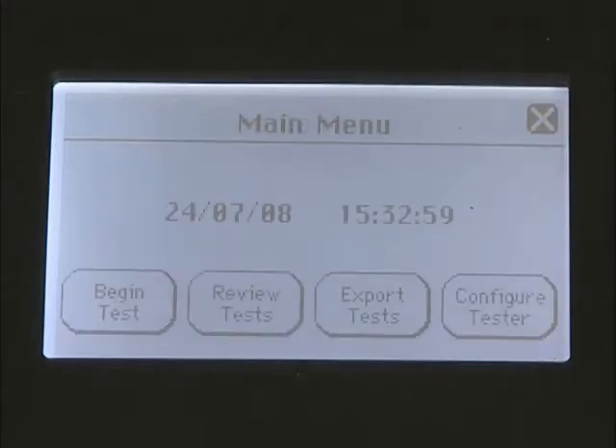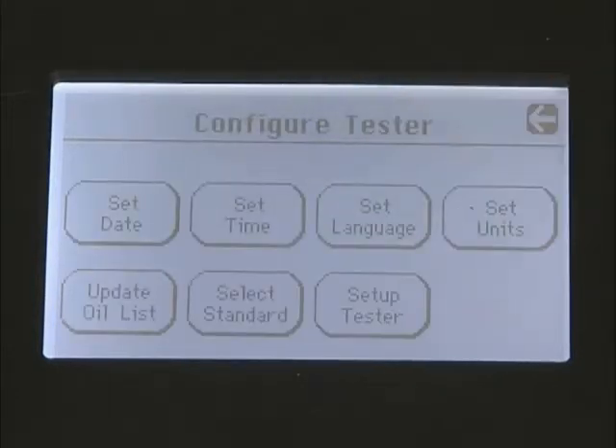Press the arrow key to progress to the main menu, where the current date and time will be displayed. To change the default settings such as date, time, language, and units of measure, enter the configure tester screen.